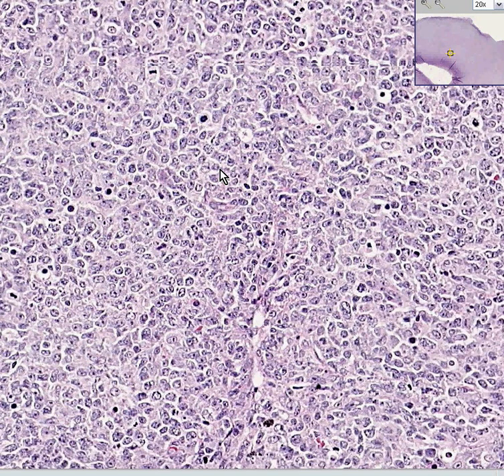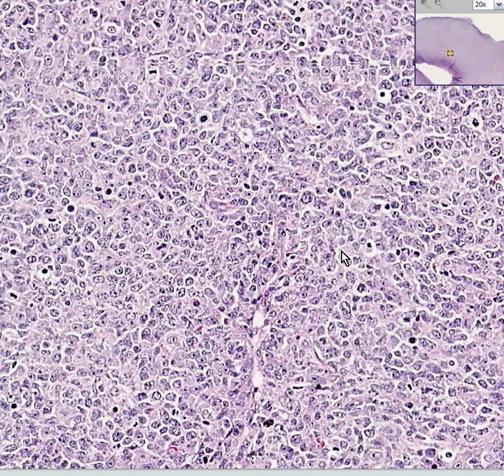The other thing I would like to say is that if you stained these cells with T-cell markers and B-cell markers, and they wound up staining positive for the B-cell markers and not the T-cell markers, then you would also correctly classify it as a diffuse large B-cell lymphoma, which it is.